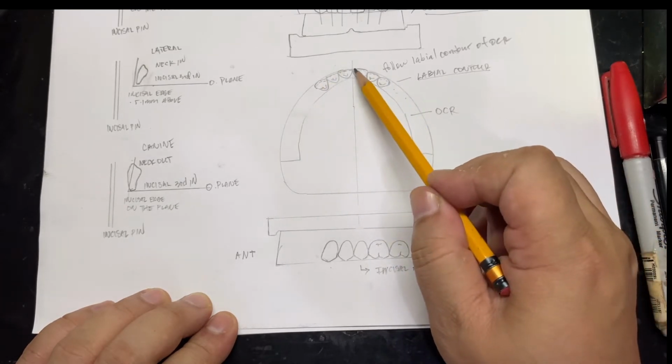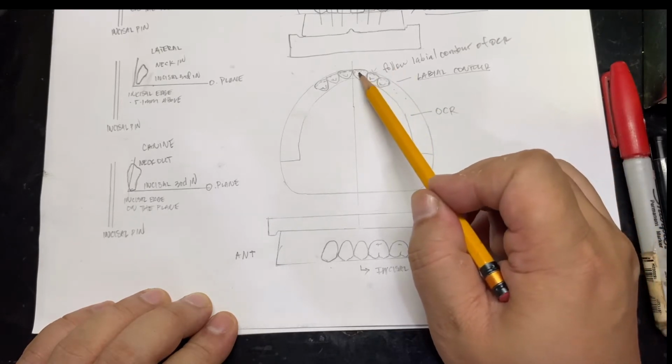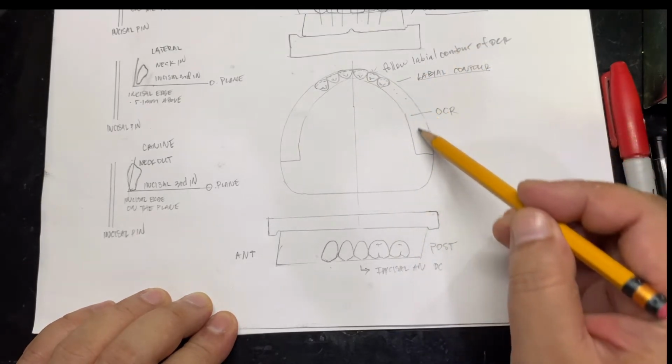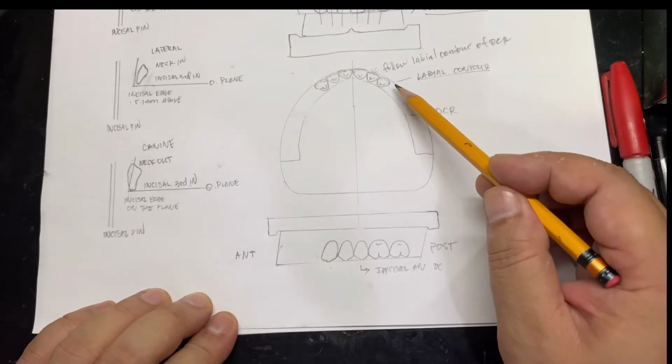Labially, you have to follow the contour, and then the lateral is a little bit in compared to the central and canine, and then you follow the contour of the wax posteriorly, because this will be your guide in setting the posterior teeth.